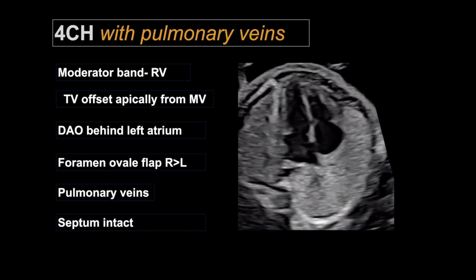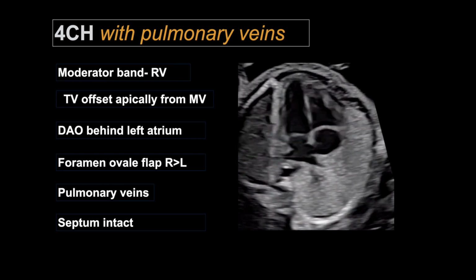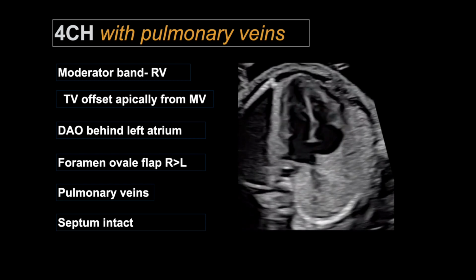So 4-chamber view now documented with pulmonary veins. These are the basic components of the 4-chamber view that we've already talked about throughout this course, but I wanted to list them there just for the sake of completeness.